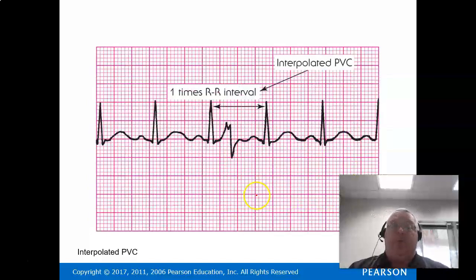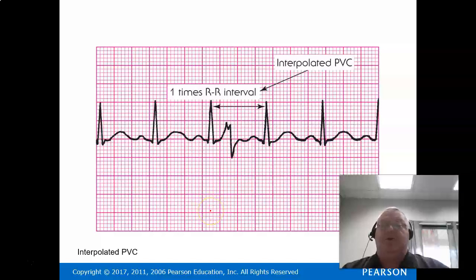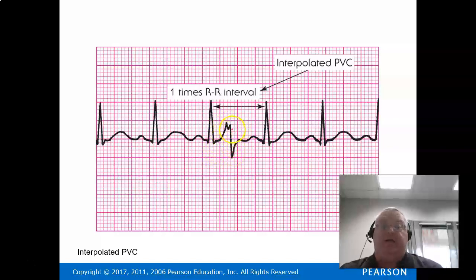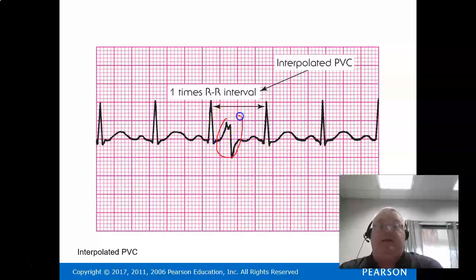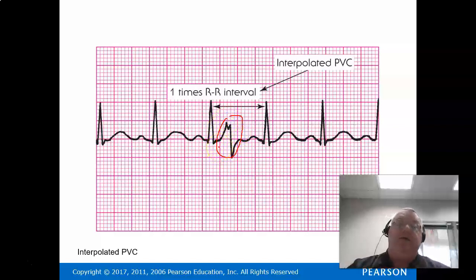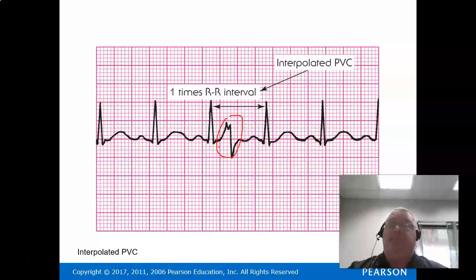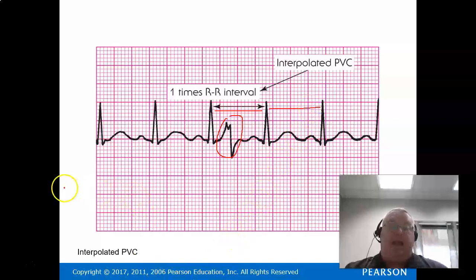This is what we call an interpolated PVC — notice the R-to-R interval is the same. This one is actually more dangerous because it fired very early in the refractory period, occurring right in the middle of the T wave. This is the one that leads to lethal rhythms — V-fib, V-tach. If you're seeing that, it's a major red flag. Notice the heart did not compensate here; the R-to-R is the same.